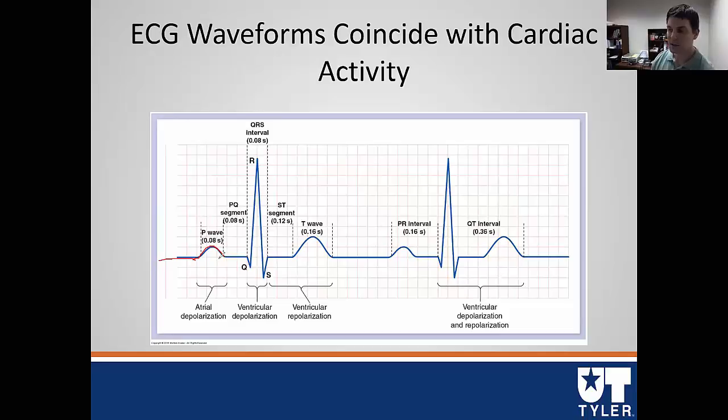So as I was saying, you should know what's going wrong. So if we see maybe an upside down P wave, or maybe we see some diseases called what's called a biphasic P wave, or maybe you see no P wave at all, what that would tell us is there's something wrong with the atria, right? It's something wrong with atrial contraction, okay?